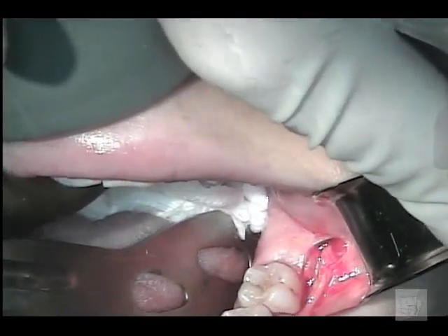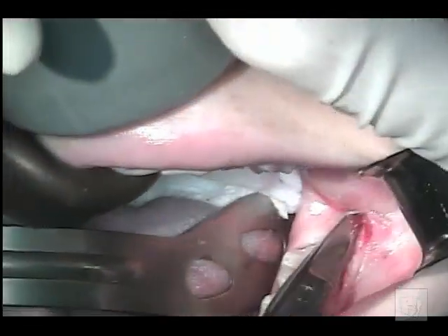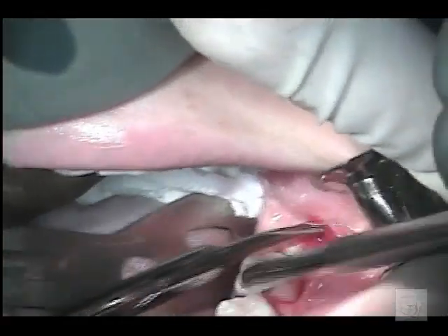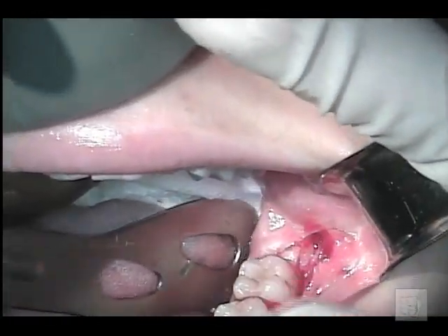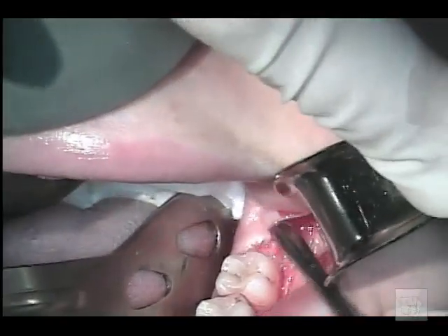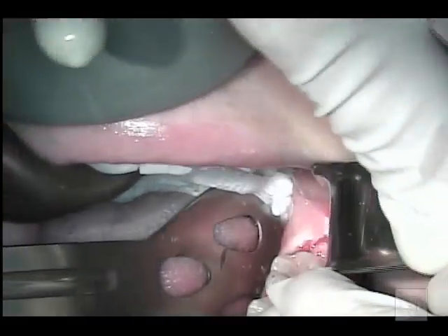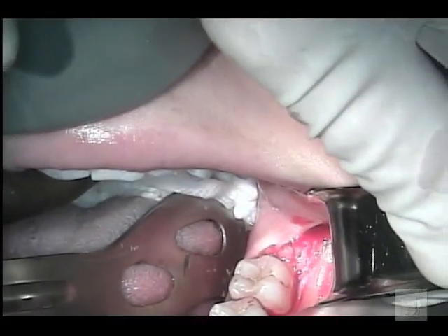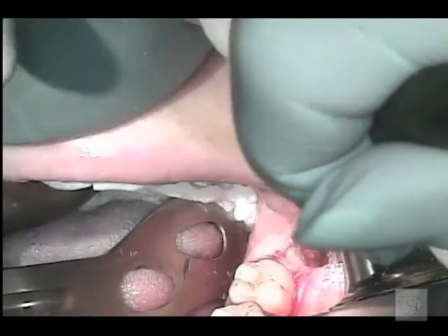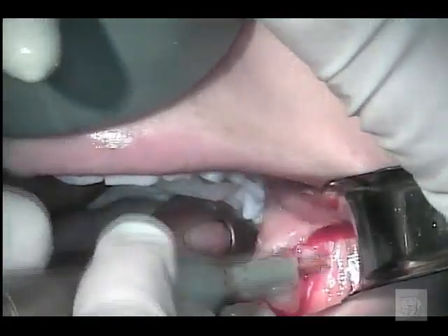Periosteal elevator is used to lift a full thickness mucoperiosteal flap, and then you can use a scissor to cut through some of the fibrous tissue there. And also I cut out a little triangular wedge of tissue over the mesiobuccal aspect of the tooth in order to increase my access to the area. Now I'm taking a periosteal elevator and pushing it onto the tooth so that I can lift the soft tissues over it and fully expose the tooth.